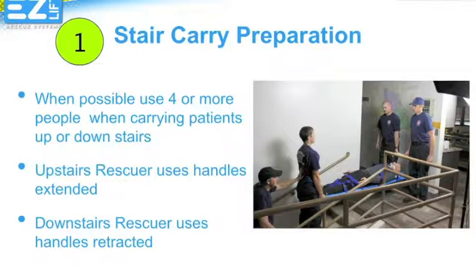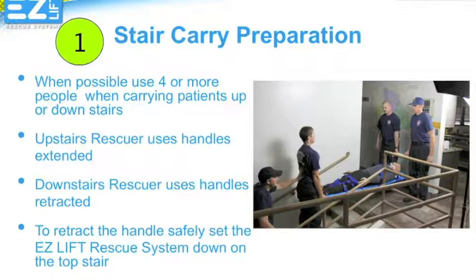When carrying patients on stairs, the upstairs responder should use the EasyLift Rescue Handles in the extended position. The downstairs responder should use the EasyLift Rescue Handles in the retracted position, like a traditional spine board. To get into the correct position, carry the patient until the EasyLift Rescue System hangs off two to three stairs, then set the system down and retract the handles. This position will allow you to keep your back and arms straight and walk down the stairs at a measured pace in a natural, safe position, while still keeping the patient relatively level.